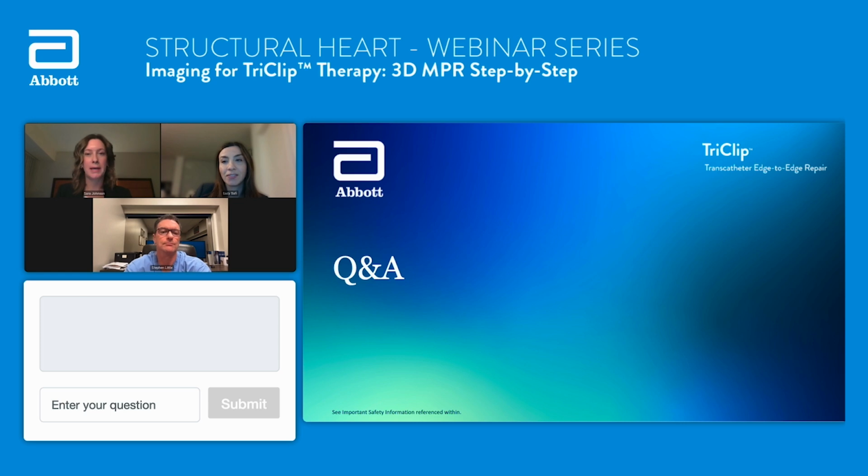Okay, thank you. Another one: when is the TEE MPR utilized versus biplane at the bicom view and confirming with transgastric? I'll jump on that first, Lucy, but I'd like to hear your answer to this one as well. I think the reason there was so much focus on MPR is that it's becoming increasingly recognized that it's increasingly useful to see everything at once, to be able to see trajectory and implant and 3D and orientation and positioning across the target landing zone, the intercommissural, if you will, or the coaptation zone.